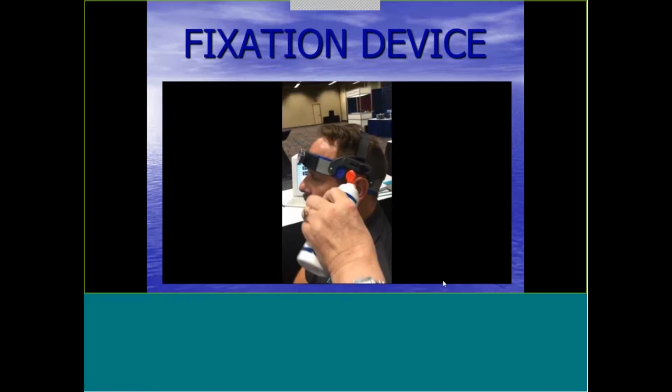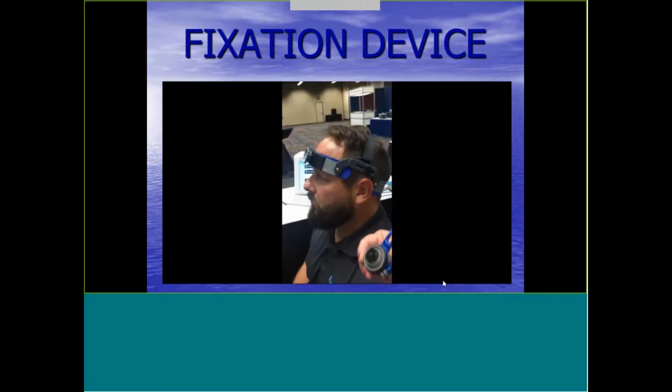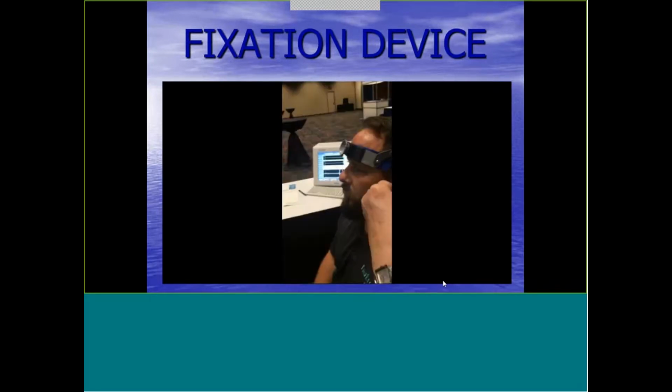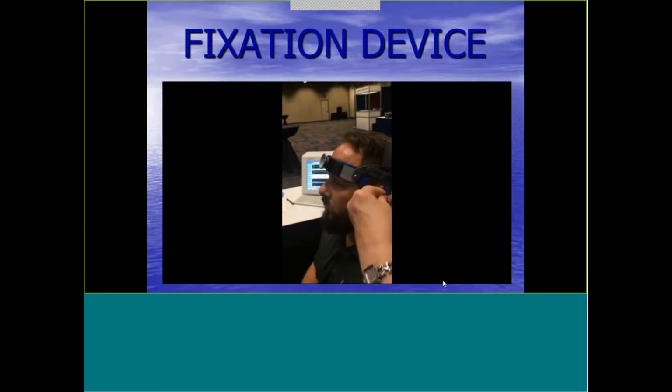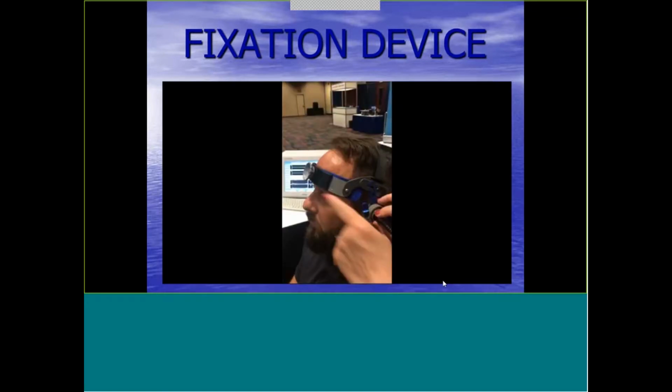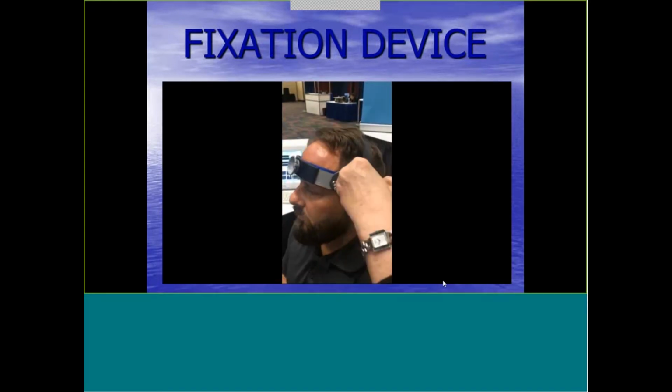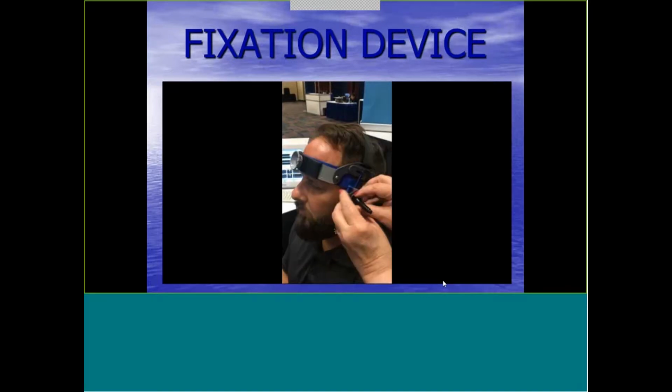Katie's going to do another little demonstration. Some gel on my transducer, which is threaded into the transducer holder. When you apply this, you want to make sure that the blue knob is facing towards the front. So I'm going to just place this. This can move back and forth across the window. I'm going to place this on Sean, and I'm going to just lightly tighten this while I begin my exam.